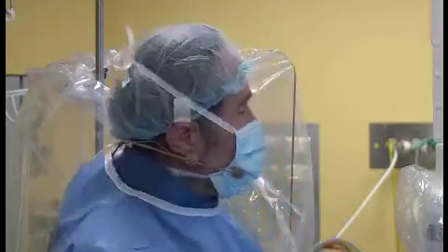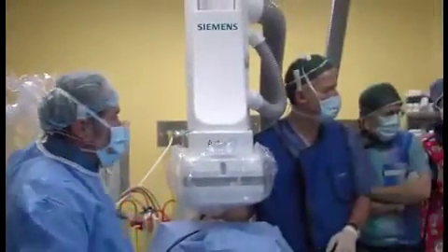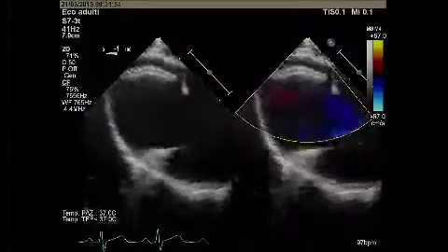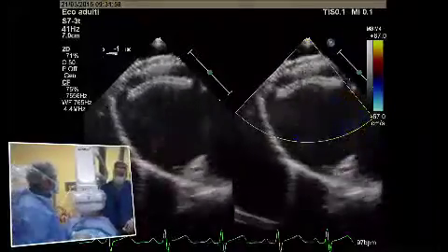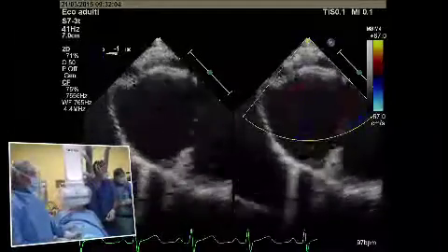Any comments, Aki, about this? No, I think the device sits very well, and as we can see, the amount of color in the mesh of the device is disappearing as we talk, and I think, as I said before, 15 was the right decision. Okay, 15 was the right choice, and I think this is it.